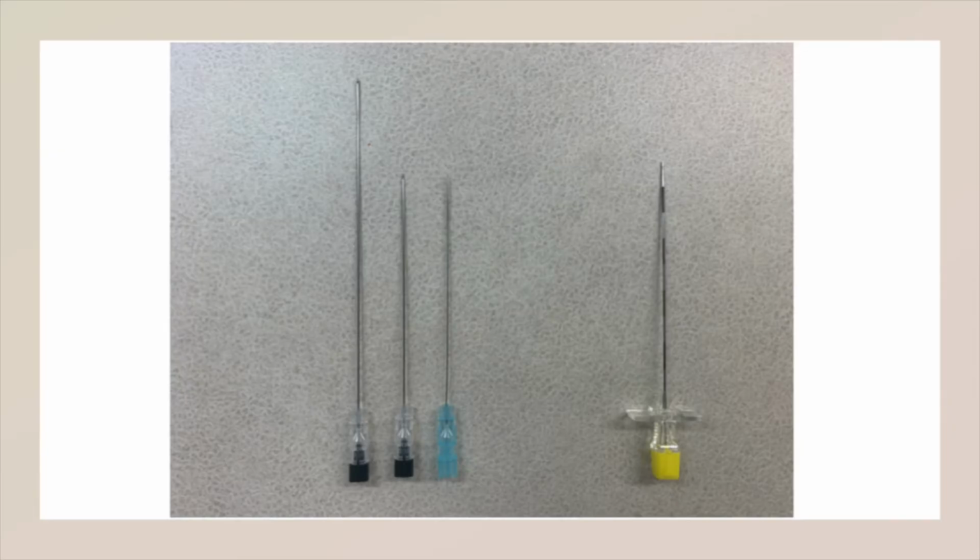Next, we will go over the common types of needles used during fluoroscopic guided procedures. On the left, we have 3 Quincke needles with different gauges and lengths. These needles are most commonly used in the transforaminal epidural steroid injection approach. On the right is an example of a Tuohy needle, which is most commonly used in the interlaminar epidural steroid injection approach.